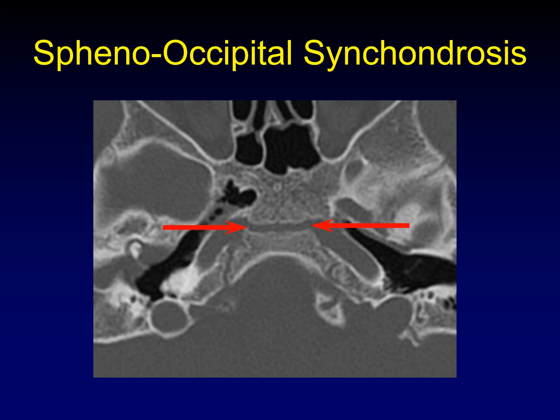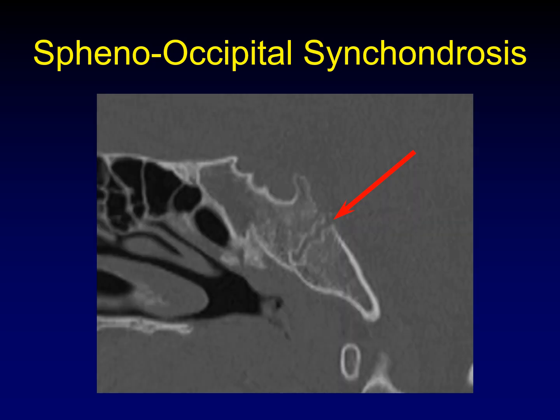The sphenooccipital synchondrosis occurs between the basi-sphenoid bone and the basi-occipital bone, and it marks the very center of the clivus. This synchondrosis completely fuses when people are in their early teens, and so adults no longer have this sphenooccipital synchondrosis. You'll see this in children exclusively, and you don't want to mistake it for a transverse-oriented fracture. It's usually easier to analyze in the sagittal plane, and here's its typical sagittal appearance, dividing the clivus in half.